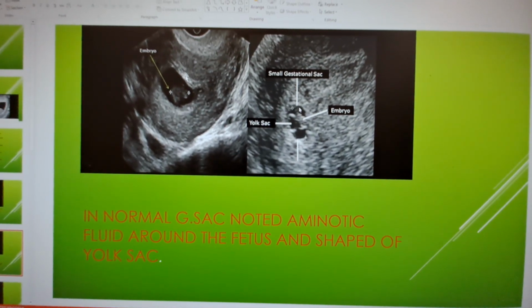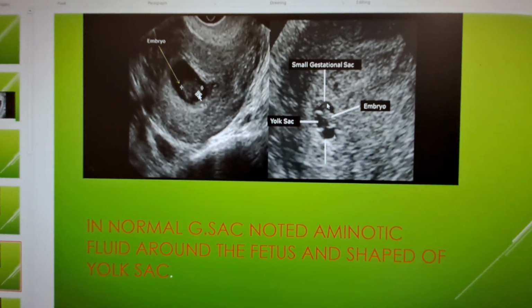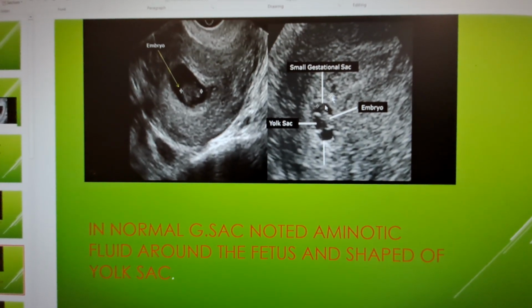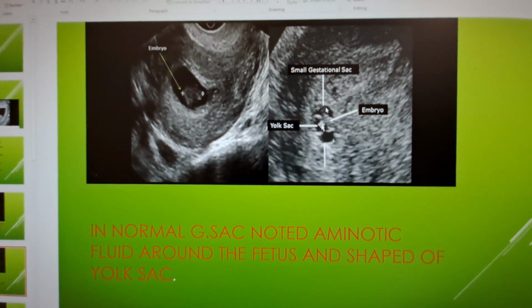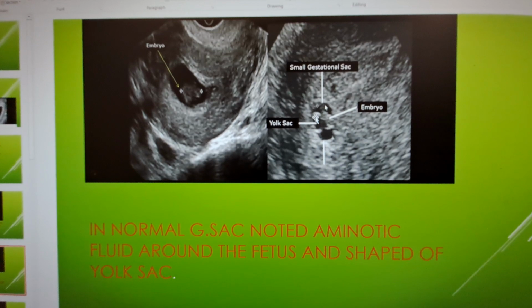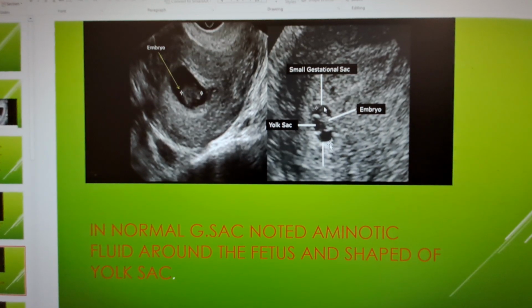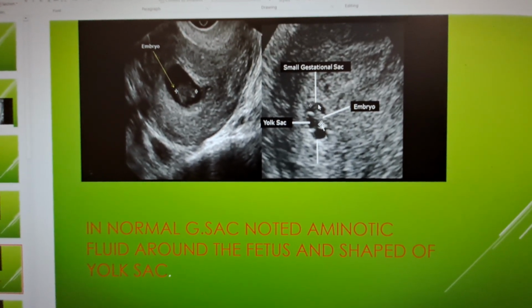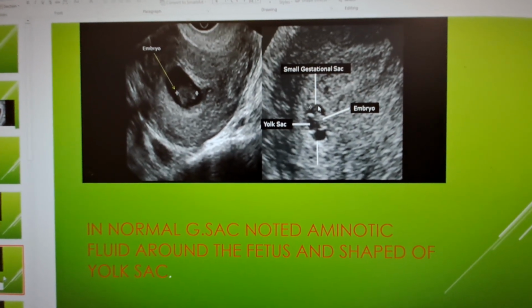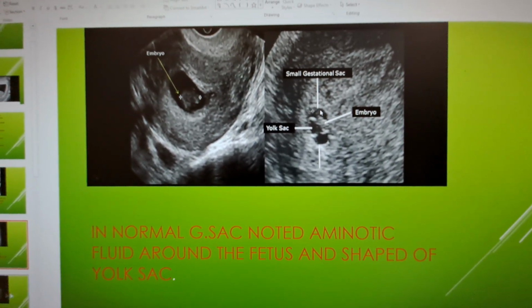Now we come back to the topic of the gestational sac. So we see the endometrium, with the decidual reaction around the gestational sac, and this is the fetus. This is the normal pregnancy, but here, although this is the decidual reaction, the size of the gestational sac compared to the fetus is not normal. The yolk sac looks big. So this is also a sign that the outcome of the pregnancy may not be good, or it may be a threatened abortion going toward genetic or chromosomal abnormality.